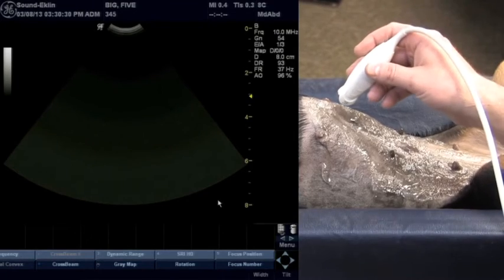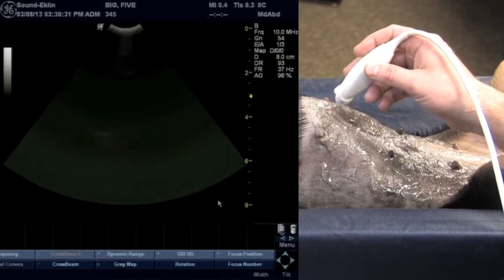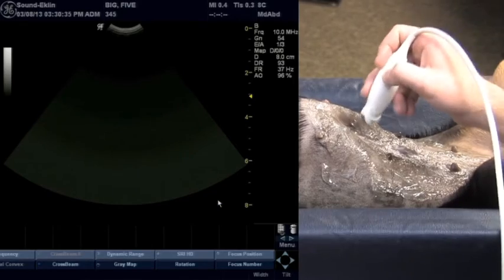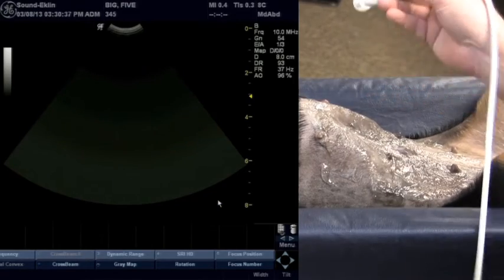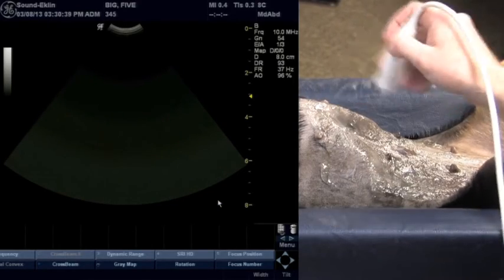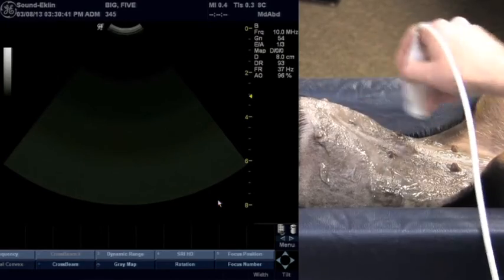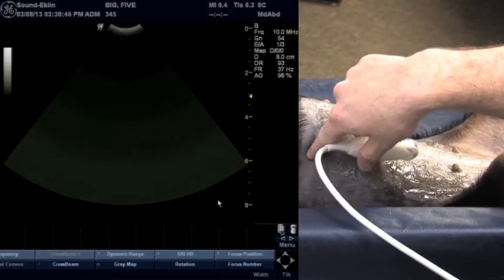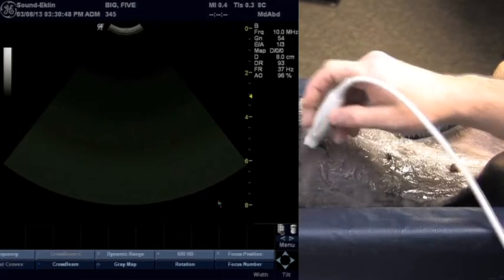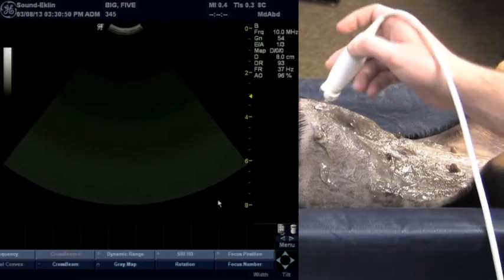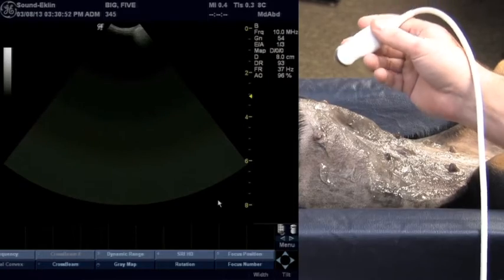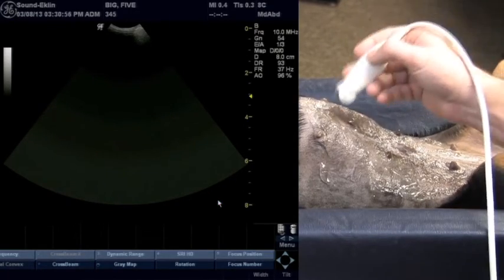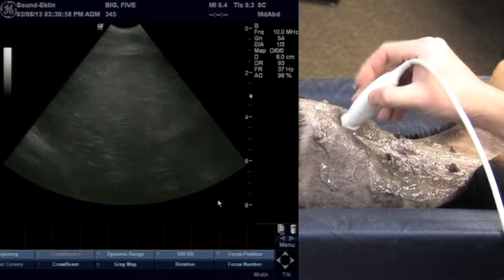We're going to begin our tour of the big five starting with the liver, then moving on to the spleen, kidneys, and urinary bladder. The patient is positioned in dorsal recumbency, the abdomen has been shaved — at least three intercostal spaces to give us access to the liver from an intercostal approach. I've chosen to start with an 8c probe, which is a microconvex probe; this will allow us to manipulate underneath the ribs.